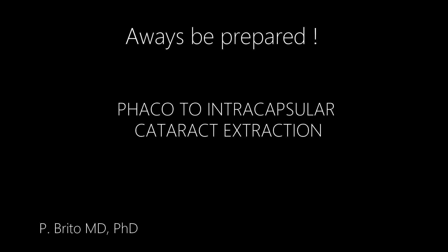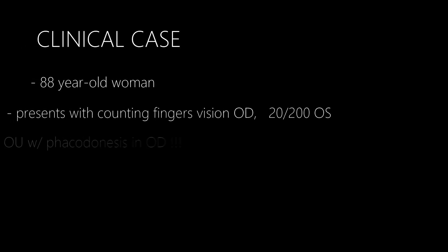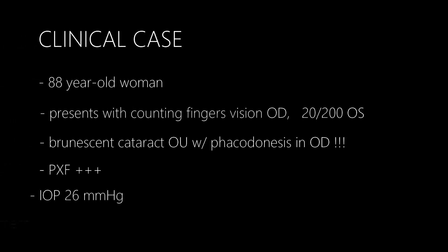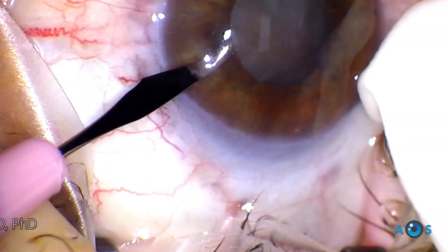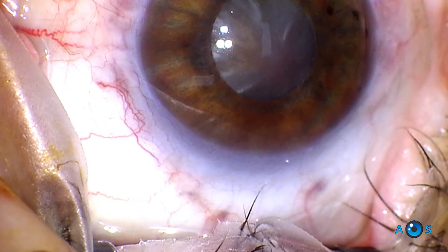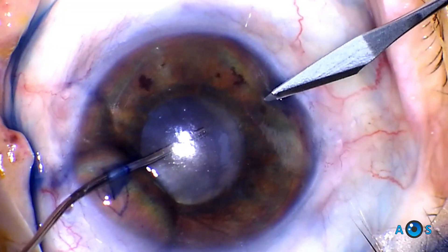In this video, we present a very complex case – a patient with bilateral brunescent cataracts and advanced pseudoexfoliation. In fact, phacodonesis was noted on slit lamp examination on the right eye. So while phacoemulsification is to be attempted, the surgeon must be ready for alternative surgical techniques.